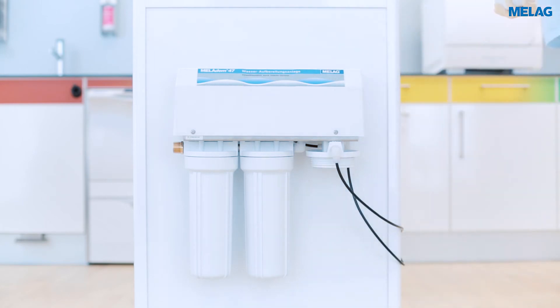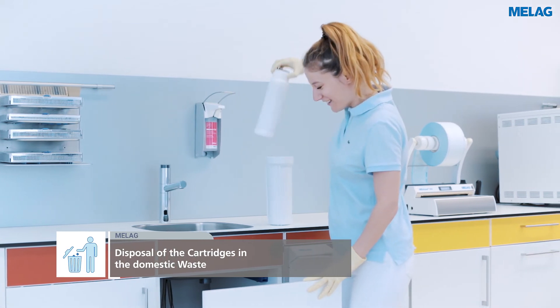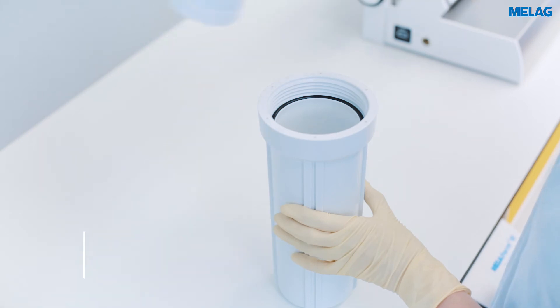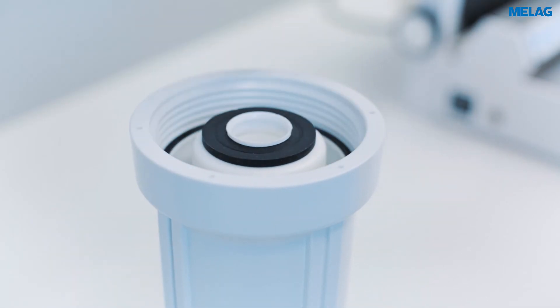The exhausted cartridges can be disposed of in the domestic waste. When inserting a new mixed bed resin cartridge, please ensure that the flat seal of the cartridge points upwards.